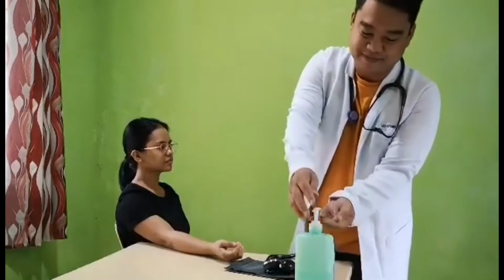Okay, let us proceed with our discussion, and I am now going to demonstrate to you how you are going to obtain the blood pressure. Today we are going to perform a procedure which is monitoring the blood pressure of my patient. Before I start the procedure, I am going to sanitize my hands first.